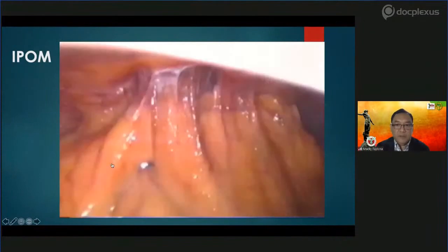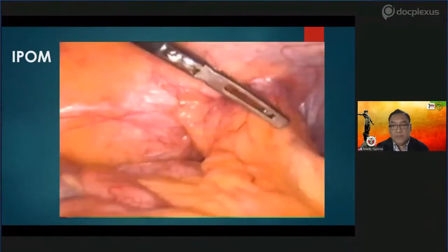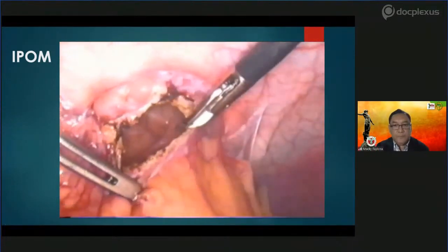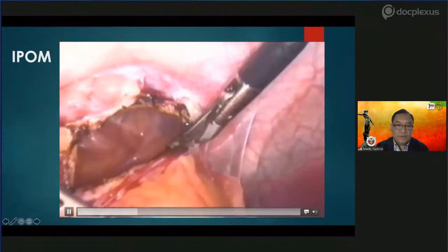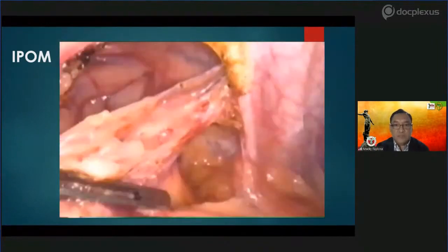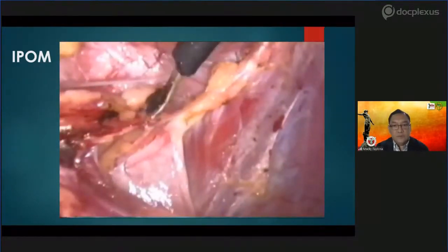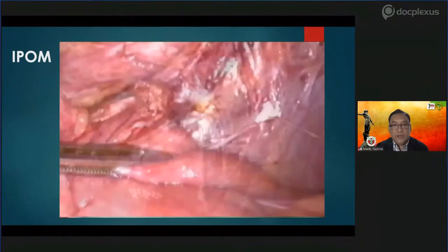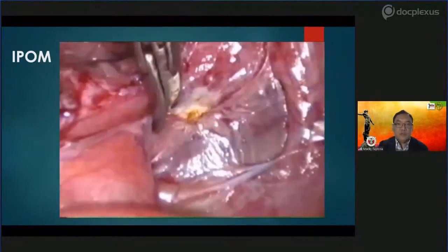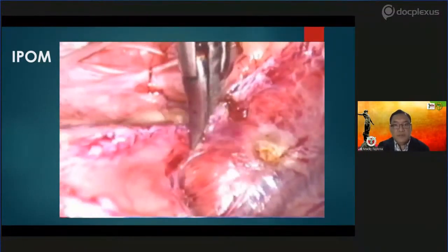Let me show you a short video. This is an old video of a patient. This is a 58-year-old male post appendectomy through a Rocky Davis incision, and he developed a hernia in the Rocky Davis site. You can only use thermal devices or hot scissors if you're sure that there's no bowel involved. What is, of course, advisable is that you use cold scissors in the adhesiolysis. Once you're done with the adhesiolysis, you measure the defect, and then you put your ventral patch. So IPOM is actually sort of a bridging patch just to close the defect.